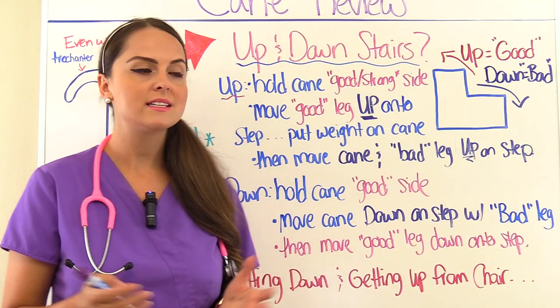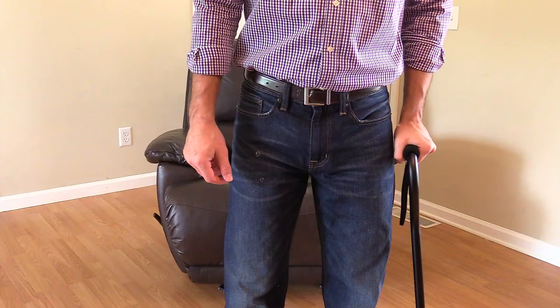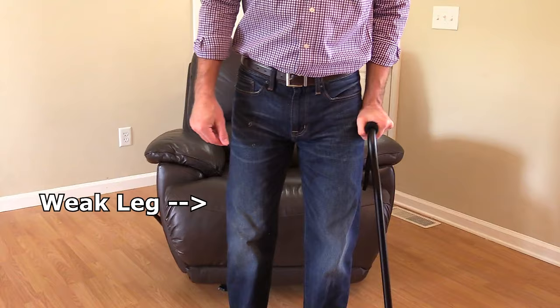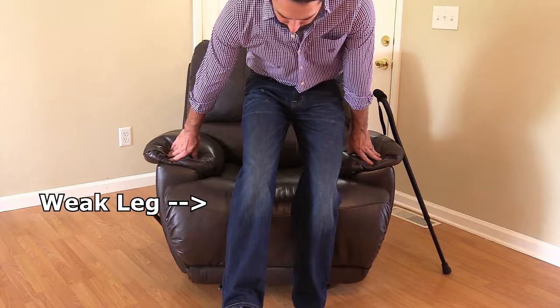Let's talk about how a patient will sit down using a cane. To sit down, the patient backs up to the chair until they feel the chair with the back of their legs. Then the patient allows the cane to rest on the side of the chair, places both hands on the chair's armrests, and places weight on the hands while keeping the weak leg extended out and bending the strong leg to sit down.